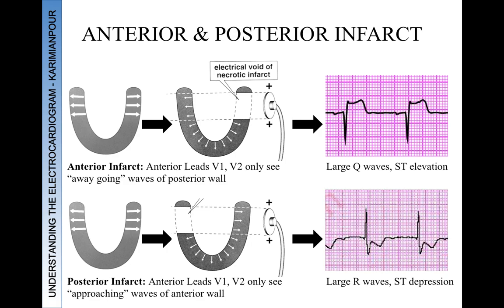that happens in a myocardial infarction. And also the electrolyte milieu that causes deflections of electrical waves in an ischemic segment. Although there's no very good understanding of why we have ST elevations, it's thought to be either repolarization abnormality in a myocardial infarction or that the baseline shifts up or down, making the segment look elevated or depressed.